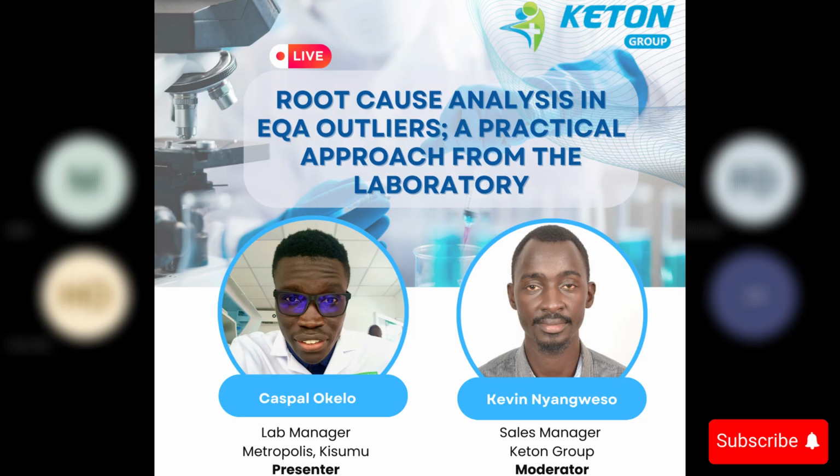Over time, there is stability around your mean, your SD and your CV, such that a single point might not result in such a big bias that it will be clinically significant in influencing your patient values. But this is also another very long discussion regarding IQC and IQC review.